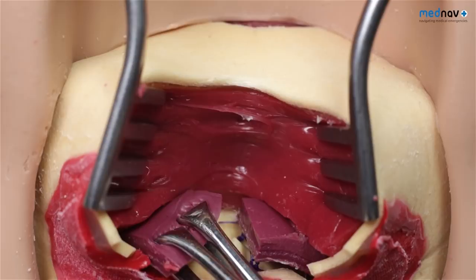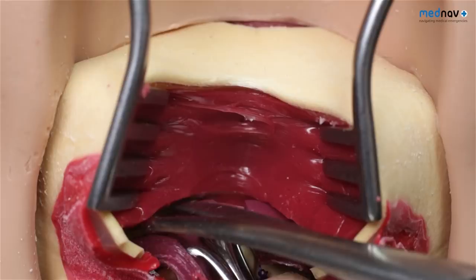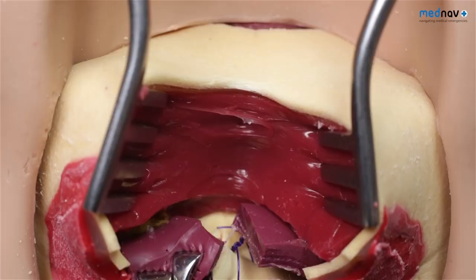The end-to-end technique involves the same technique as with the internal anal sphincter and should be used for all partial thickness tears — that is, those classified as 3A and some 3B tears.